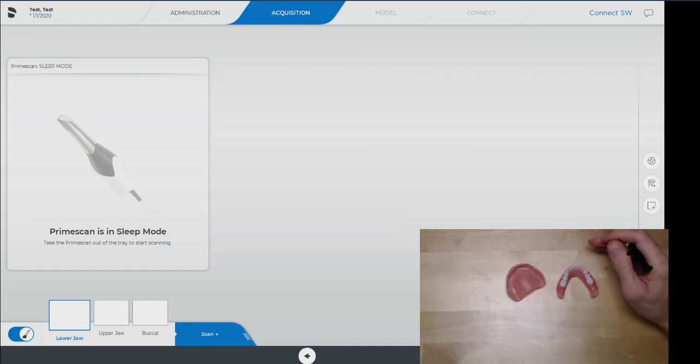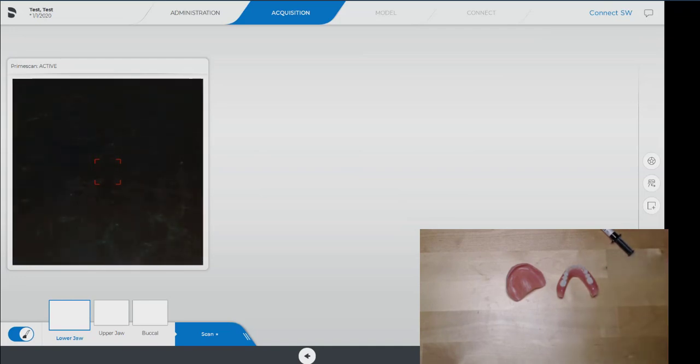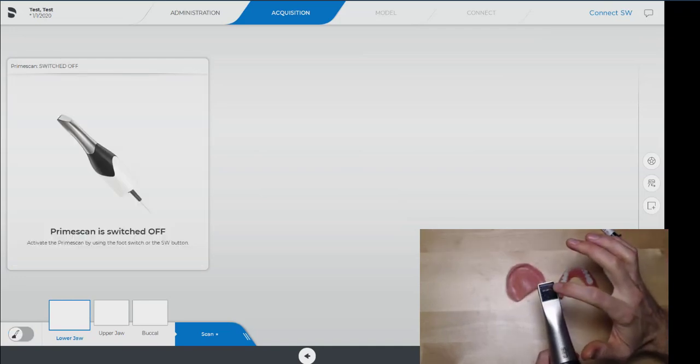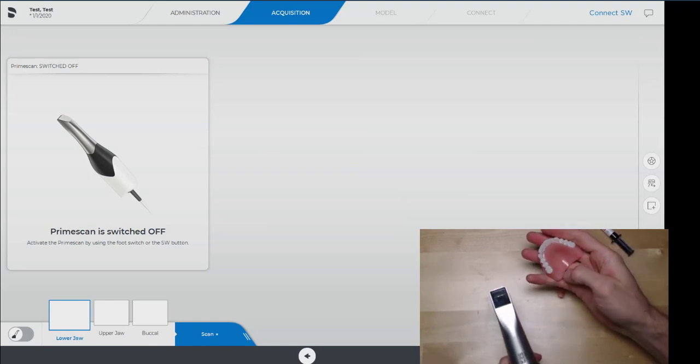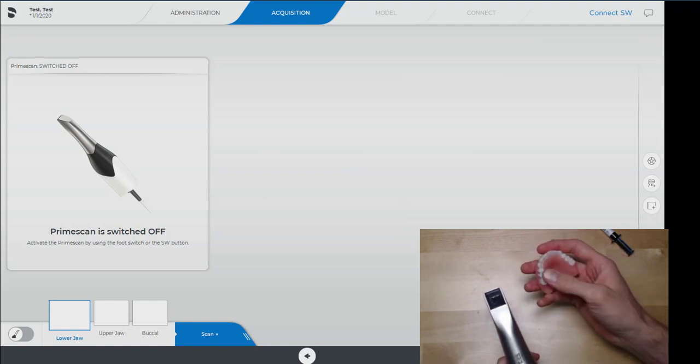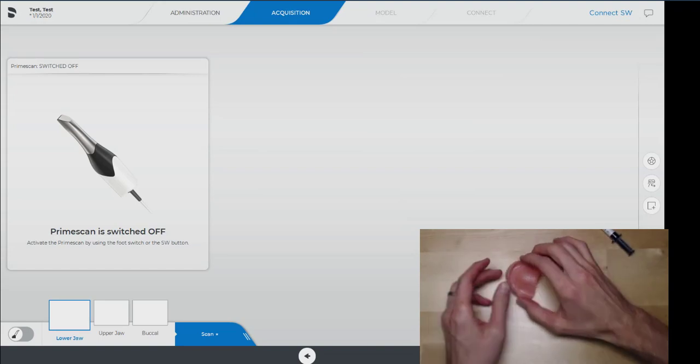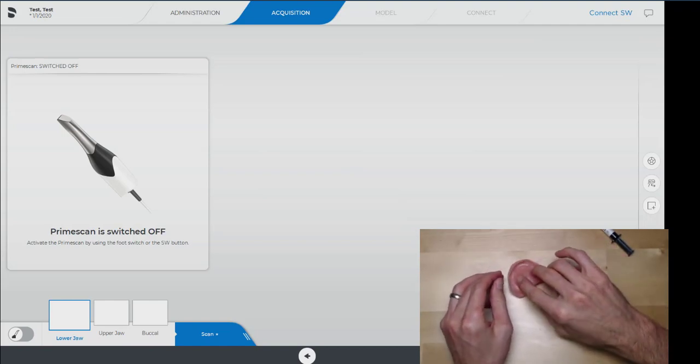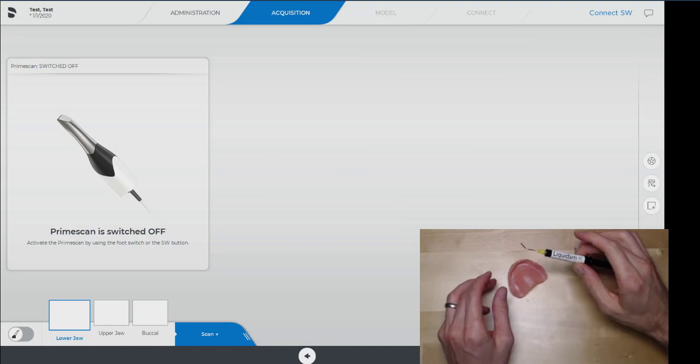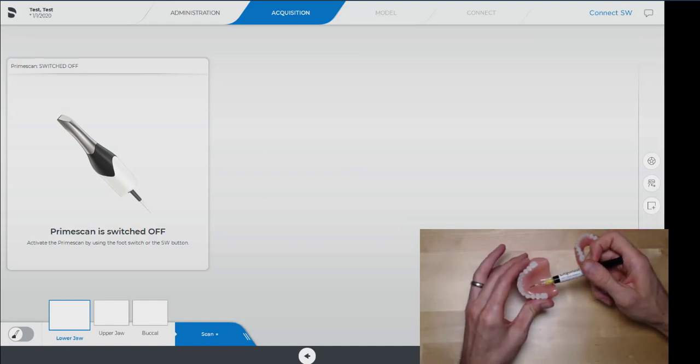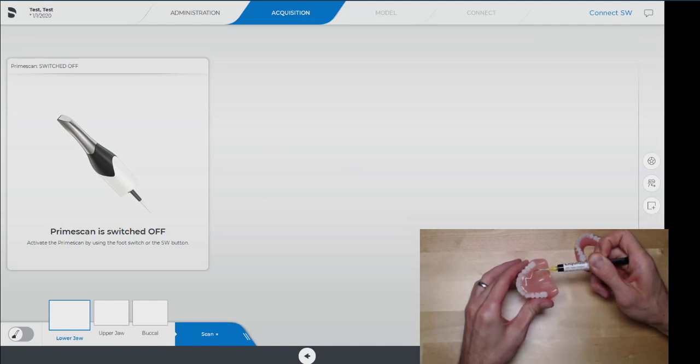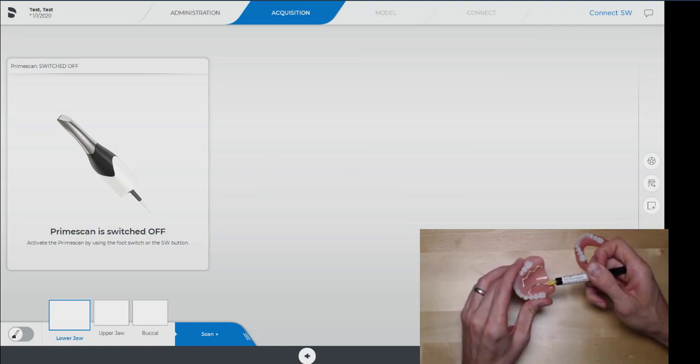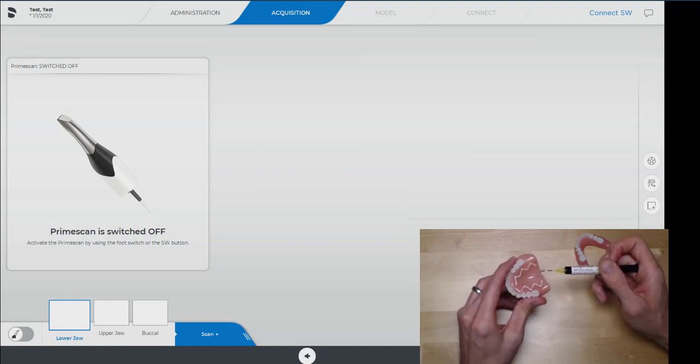The biggest consideration when trying to scan a denture is the size of the camera. When you're looking at a big smooth area like the palate of a denture that doesn't have any landmarks, you want to add landmarks to help communicate to the camera and give it some anchor points so that it can figure out where it is in space. So what we like to use is liquid dam, and you want to lay down some anchor points here just using a design, giving it some geometry so that the camera can orient itself as it scans.